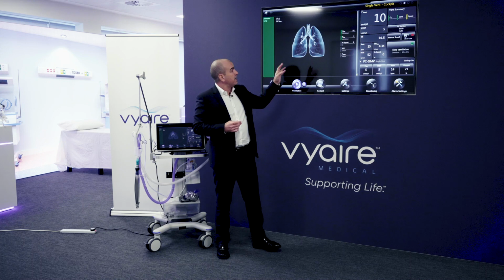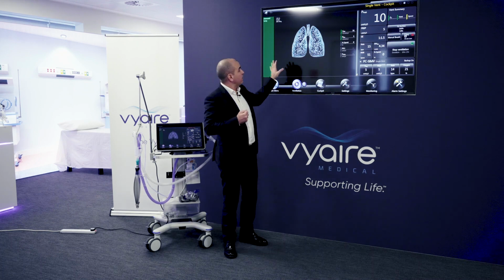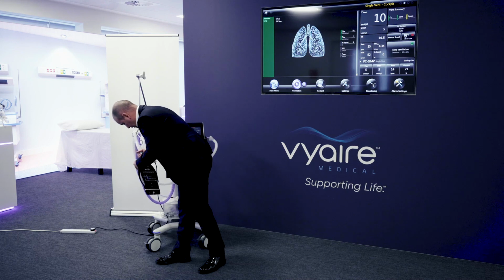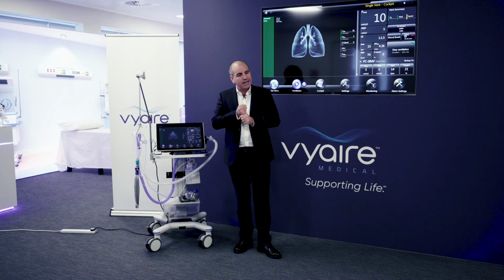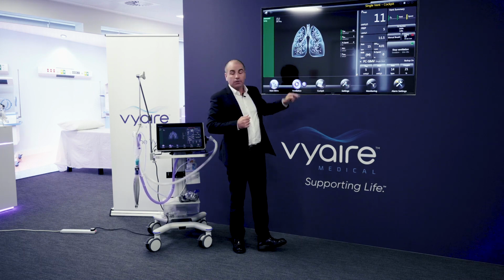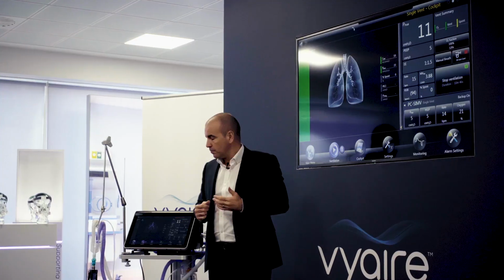It gives you a visual indicator as to what's going on with how elastic the lungs are, or potentially how tight the airways are. So here, green, all is well. What I'll do is I'll just tweak this lung here, and I've essentially made the airways tighter. So it averages over 8 breaths, and then you'll eventually see a change on the airways here. They'll start to redden, illustrating that maybe the patient needs to be reassessed.